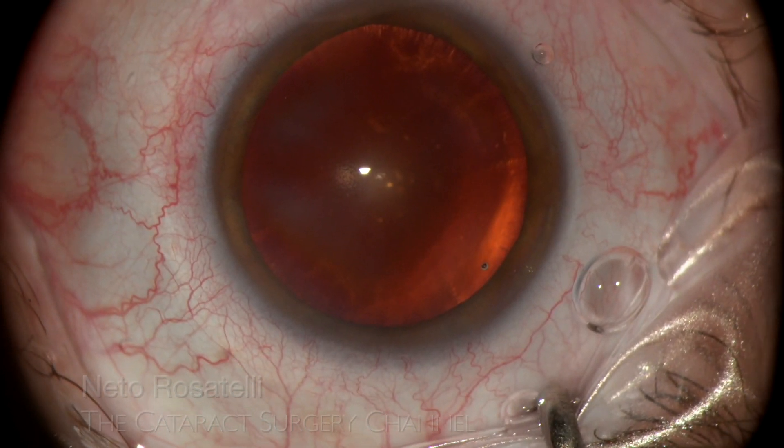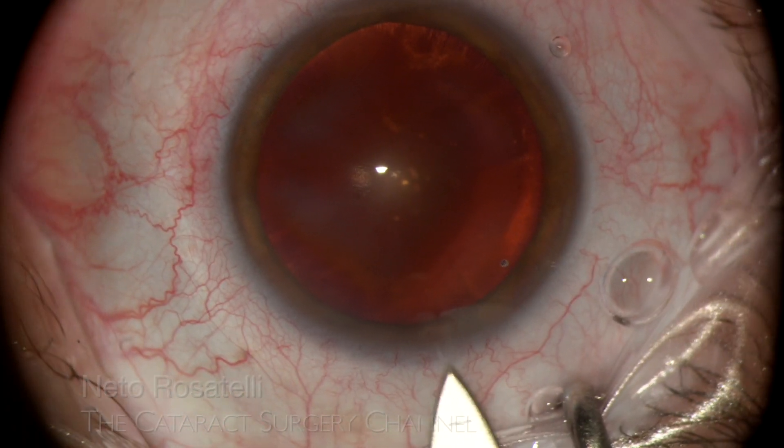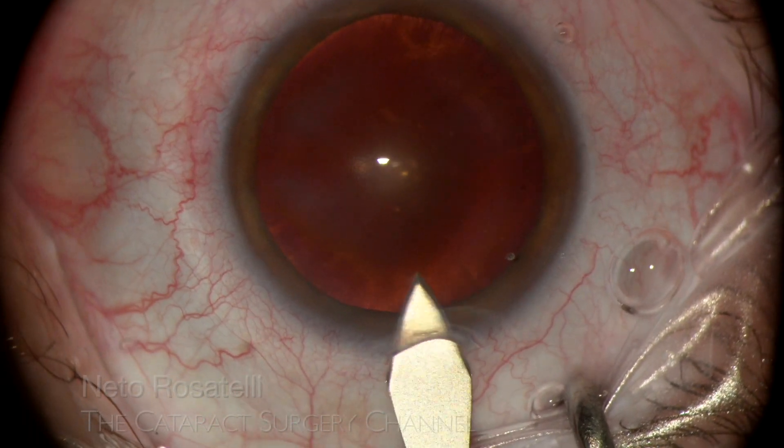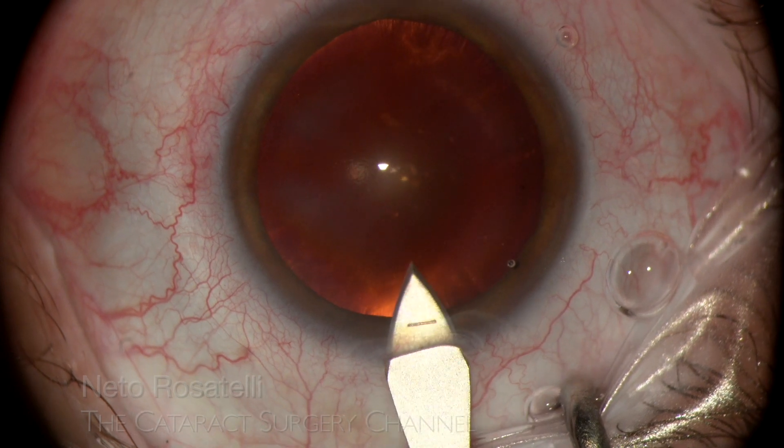A single plane incision is made with a 2.75 steel keratome. The blade marking helps to gauge the tunnel length, ideally in the 2mm range.